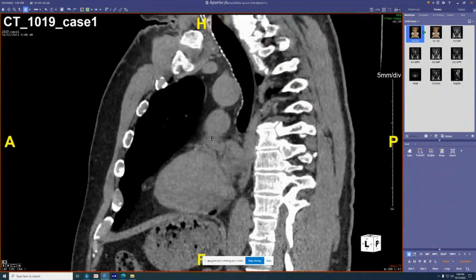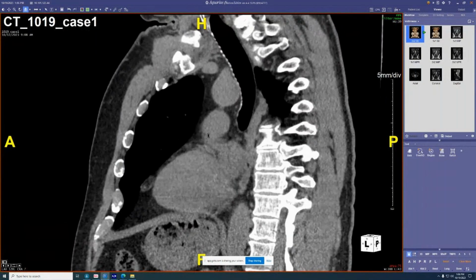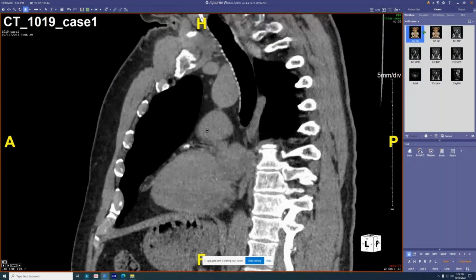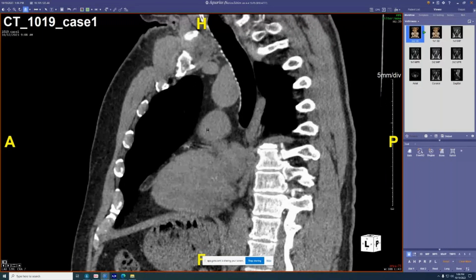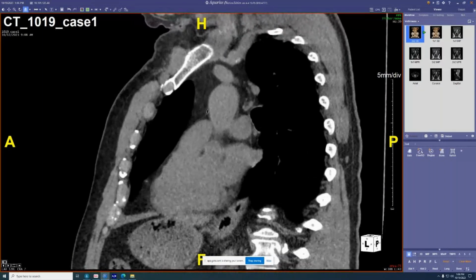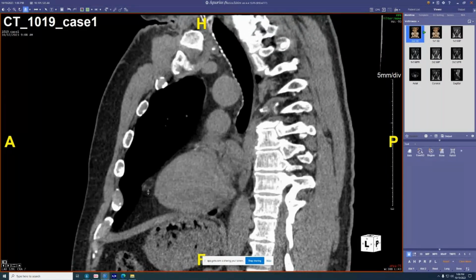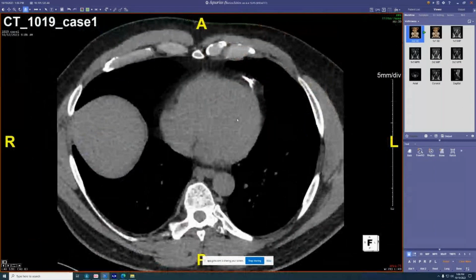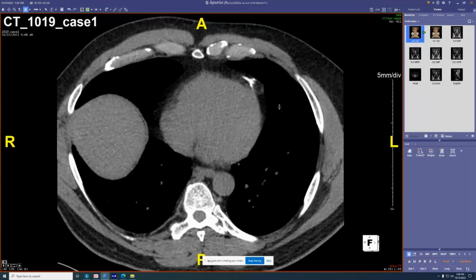You can kind of see there's a little nubbin going through it, a little vessel going through that area that looks like it's almost partially calcified. You can almost follow it in, and then it goes into this thing that's partially calcified and eventually comes out. I called this an old case of healed epipericardial fat pad necrosis, pericardial fat pad necrosis, blah, blah, blah.